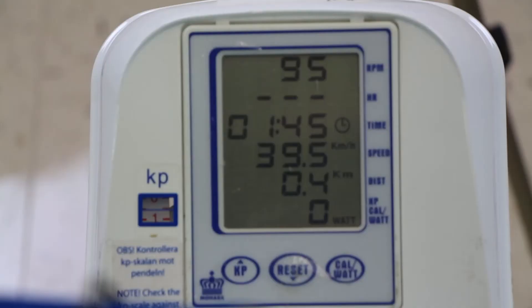This is what the screen of the Monarch bike looks like. You can easily see in the bottom left-hand side the KP, or the resistance. That resistance is not one you typically want to use because it's not always calibrated perfectly. You can also see the RPMs. If you have a polar heart rate monitor attached, you're going to see the heart rate, how long the person is pedaling, the speed of the pedaling, the distance they've gone, and some other adjustable parameters if it's set up to calculate resistance on its own.